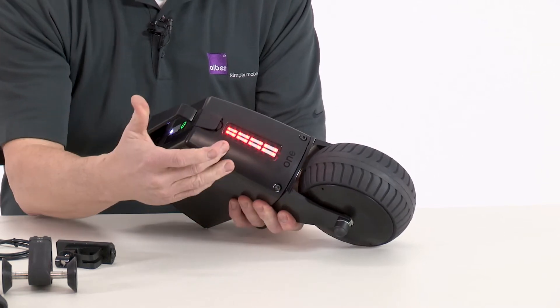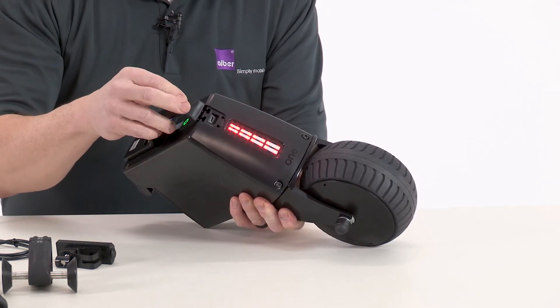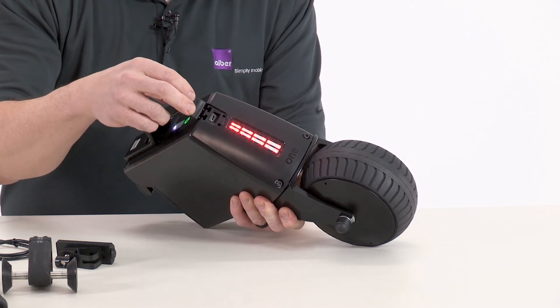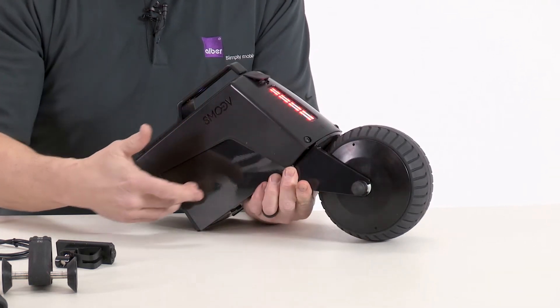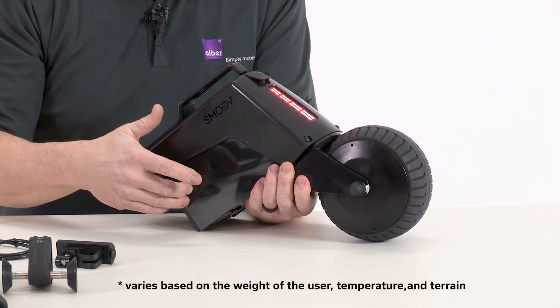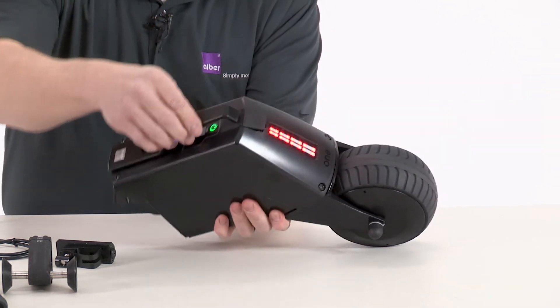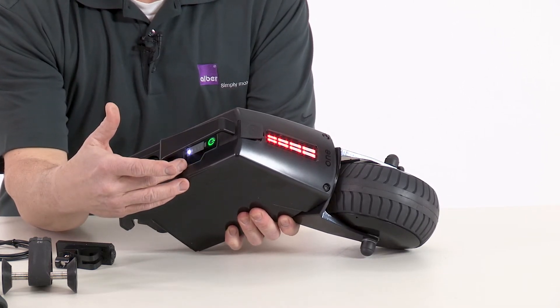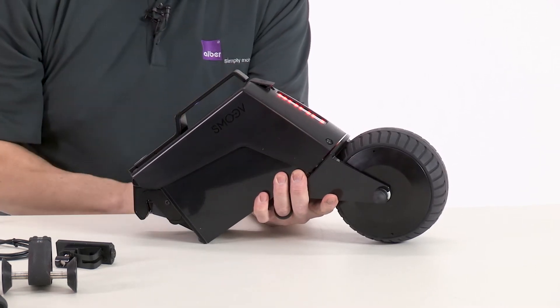We also provide a tail light for good visibility. At the top of the back, there is a USB-C charging port that you can charge either a hand control or even a cell phone off of it. We have an integrated lithium-ion battery that will provide up to 12.4 miles of distance. Underneath the handle is the on-off switch and also the battery indicator. And last but not least, we have an ergonomic handle.